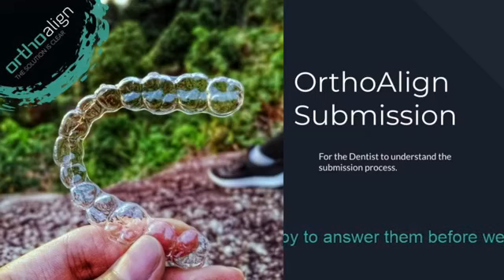They will know if there is any resorption of the bone around the tooth, what teeth they can move, and how the roots are laid out. So it's very important that when you send a submission, the minimum is the OPG with the lateral ceph. Again, it's a must-have for planning of OrthoAlign.